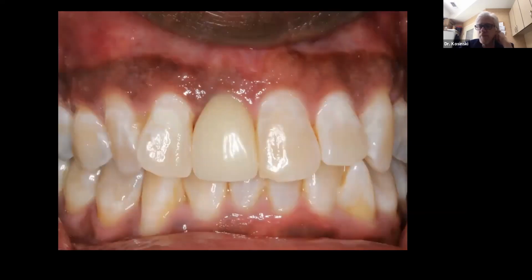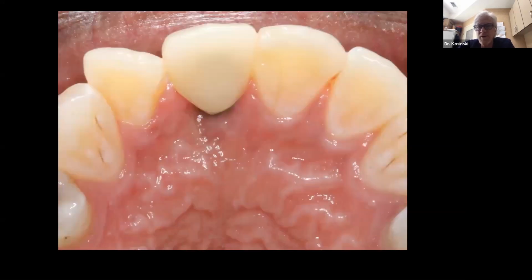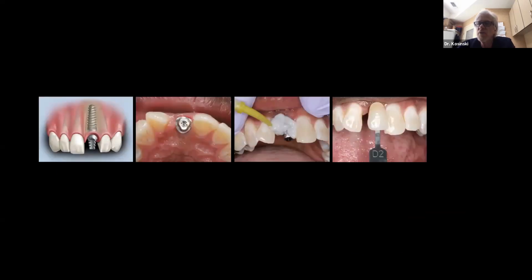The patient wore this temporary for a couple weeks, and you can see how we were able to establish interdental papilla between the 2 central incisors. Not so much on the distal aspect, but I didn't expect that. So we can grow interdental papilla very, very precisely. You can see the crown is basically shaped like a natural tooth. The laboratory fabricated for me a custom impression coping, which mimics the design of the transitional abutment that we had placed. You can see my contours are exactly the same.